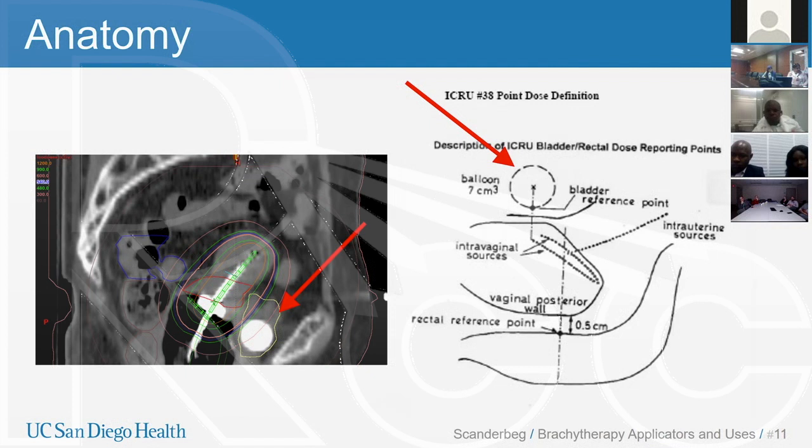Another example of a man-made feature that might be encountered is the presence of rectal contrast or contrast-impregnated packing. Much like the insertion of the Foley catheter, a small catheter can be placed in the rectum and contrast injected prior to imaging to help with visualization of the rectum. Likewise, packing in the vagina to hold the implant in place and increase the distance between the implant and the rectum can be impregnated with contrast to help visualize the posterior vaginal wall. However, when using the contrast, it's important to be careful not to create artifact in the scan that prevents visualization of the applicators or the source paths.